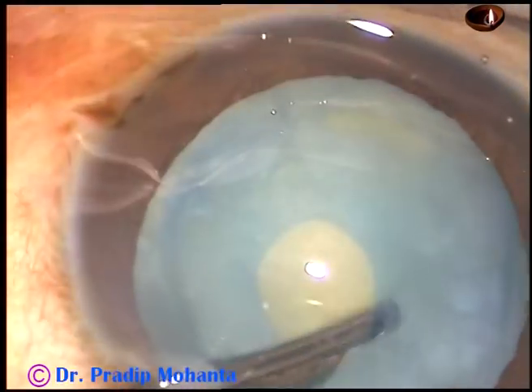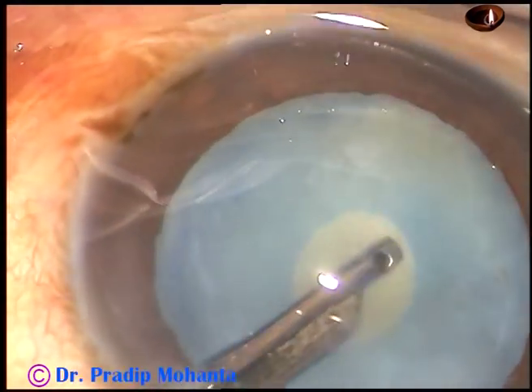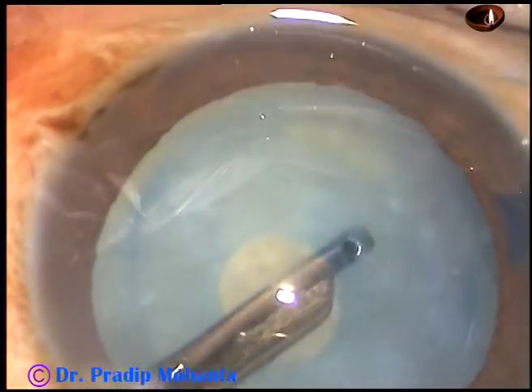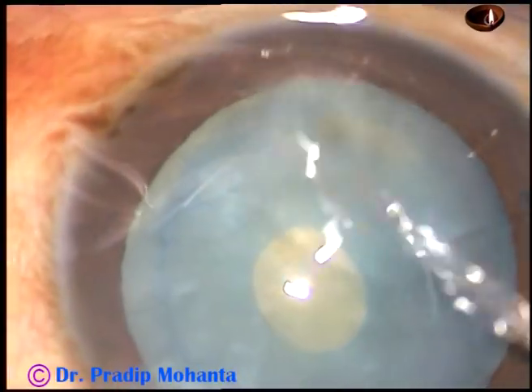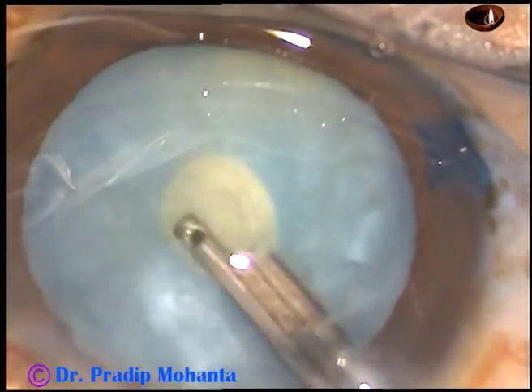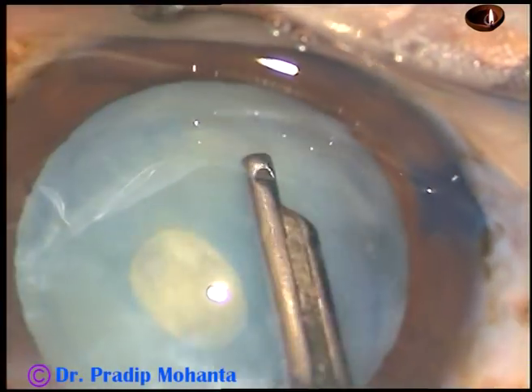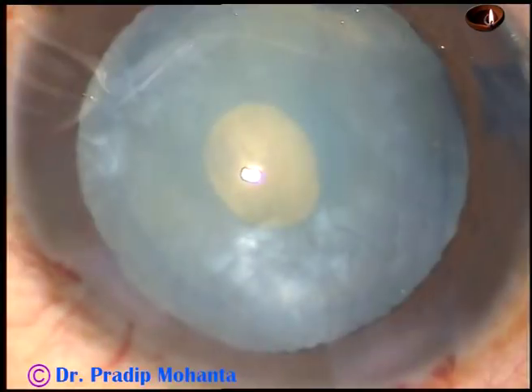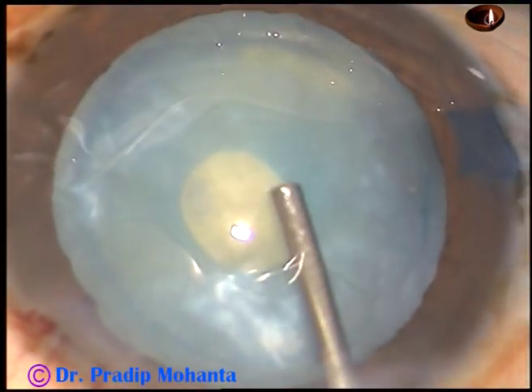So you can go through the side ports and aspirate some cortical matter. You can use bimanual irrigation aspiration instead of Simcoe if you want. See, this cortical matter is coming out, and after reduction of intralenticular pressure, this cataract is just an ordinary cataract.